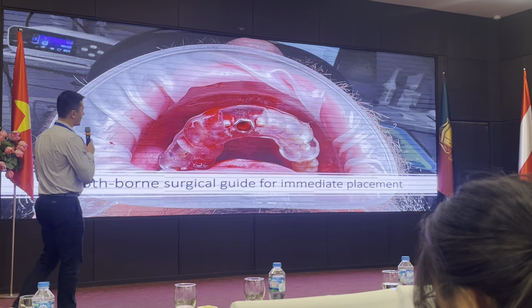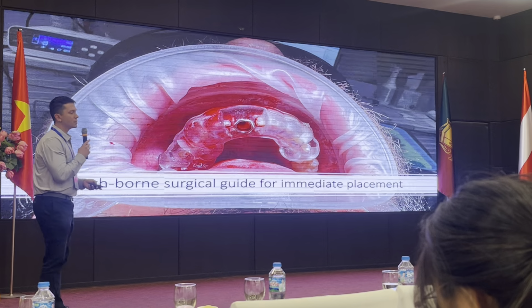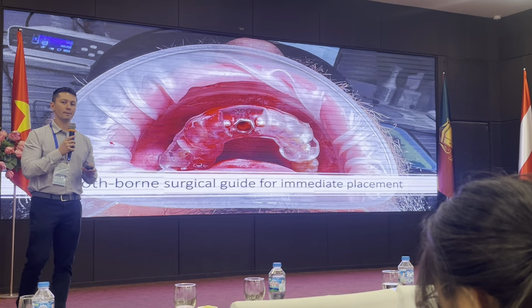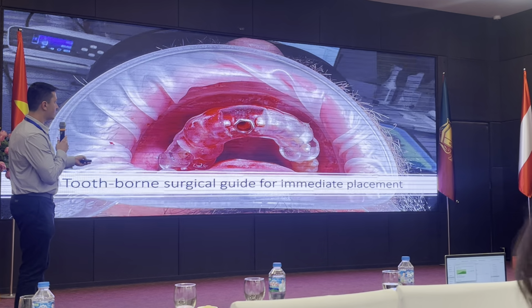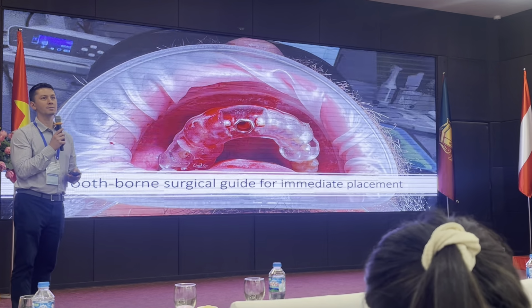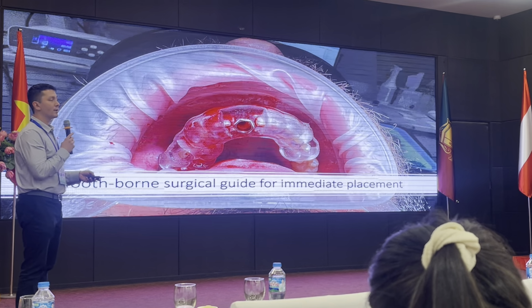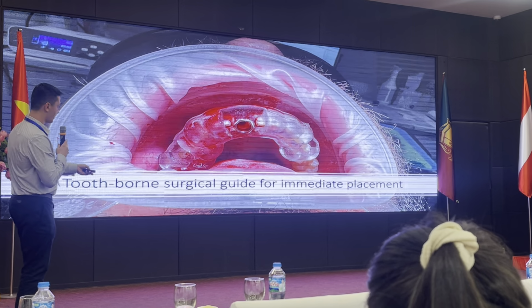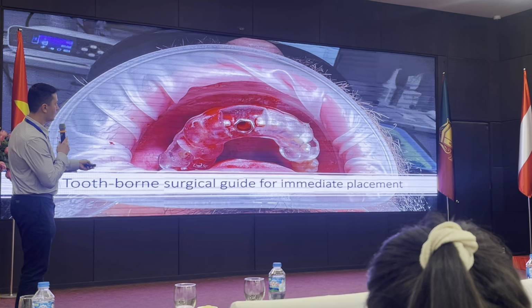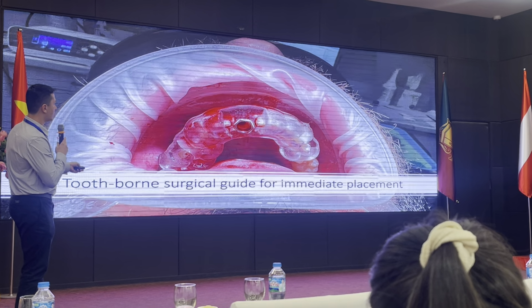We seat the surgical guide, and we also have these little cutouts right here, and over here, and over here, and over here. These are windows that were designed in RealGUIDE, and the reason we have these little windows is so we can make sure that the guide is fully seated. Sometimes the guide may look like it's seated, but it may have something preventing it from seating all the way. We would never know unless we have these little cutout windows right here. So we should see the guide fully seated against the tooth and no empty spaces.